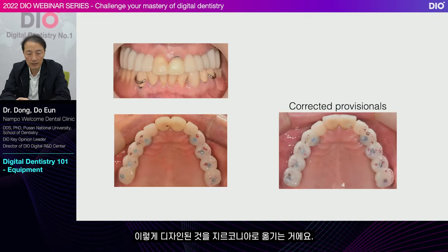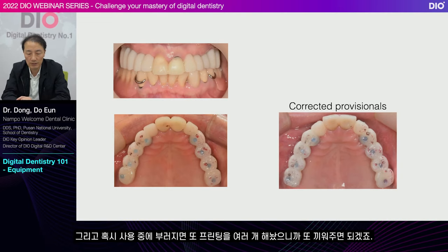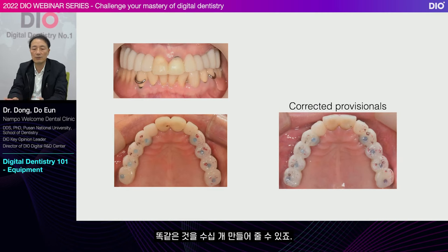The design then gets transferred to zirconia. I go through several modification steps. If the first provisional is not satisfactory, or if I want to lift or lower the VD a little bit, then I print the provisional a few times and try them on. And if it breaks during use, I can place the ones that I already printed out. You can think of them as clones, like I mentioned earlier. You can make tens of the same one.